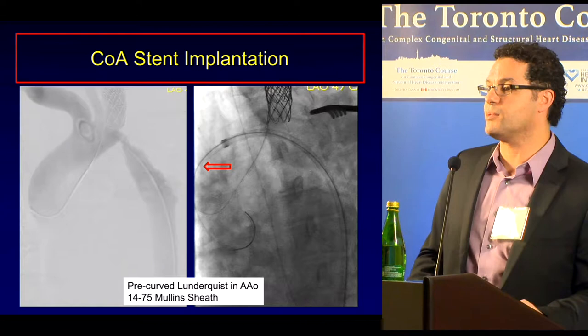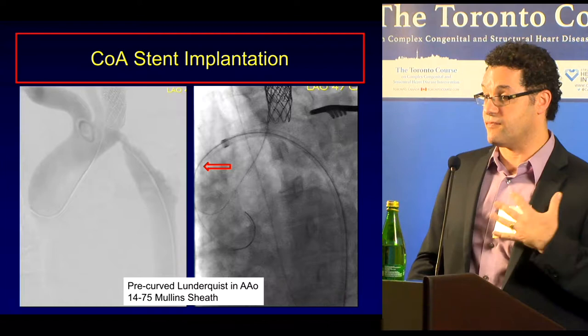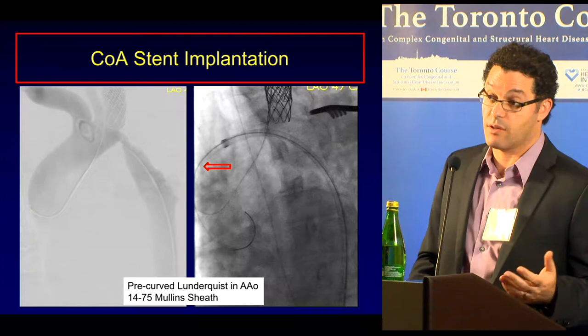No, correct. The vertebral is not jailed, but subclavian flap repairs were not done in 40-year-olds. 40-year-olds, as far as I'm aware, don't tolerate very well having an acute removal of flow to their subclavian, although I don't know, so that still is possible. 3% are symptomatic. Okay.